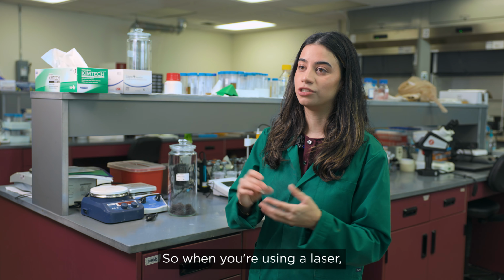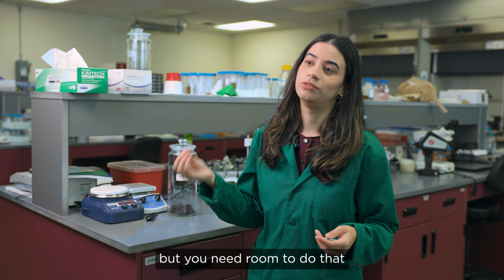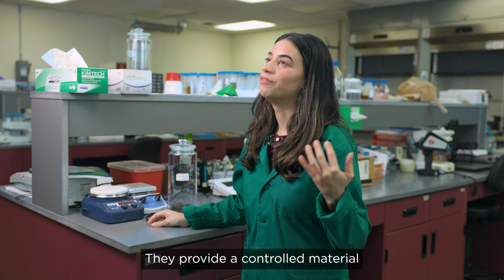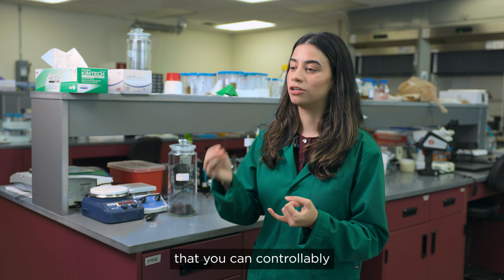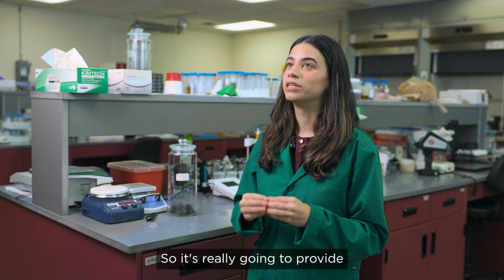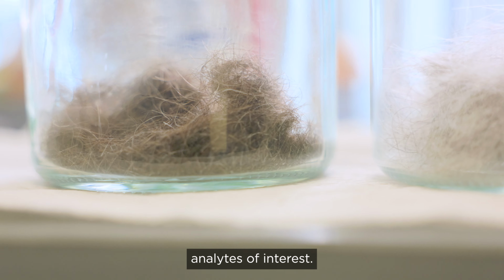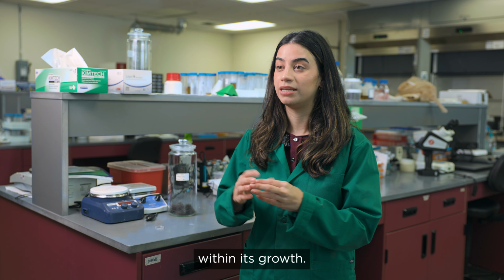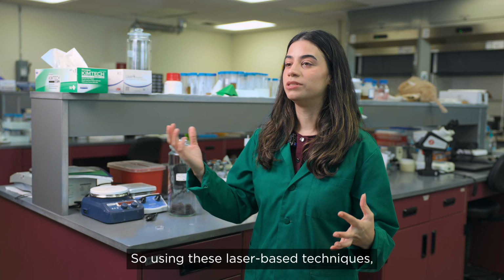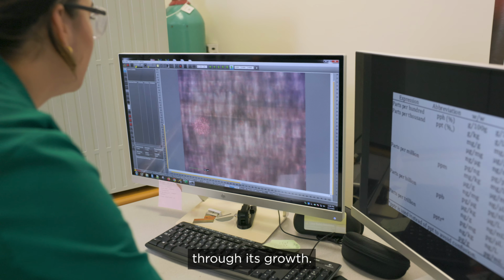So when you're using a laser, you want to be able to sample directly from the material, but you need room to do that, so the surface area is going to matter. So these enhance that. They provide a controlled material that you can controllably dope with your analytes of interest, such as the metals or the metabolites. So it's really going to provide an accurate quantification of these analytes of interest. Hair does provide a lot of information within its growth. As it grows, the information is going to grow along the hair strand. So using these laser-based techniques, we are able to get information directly from the hair through its growth.